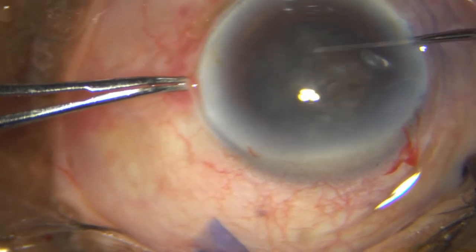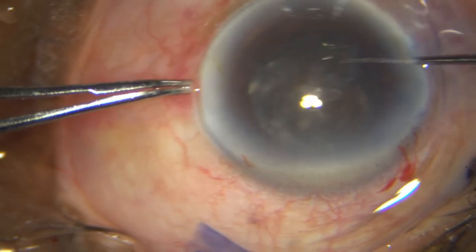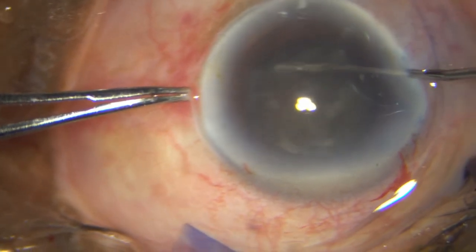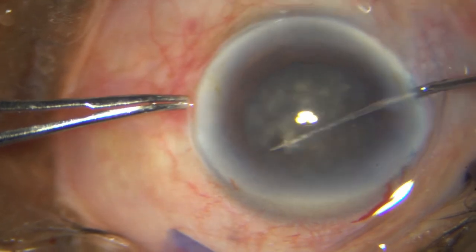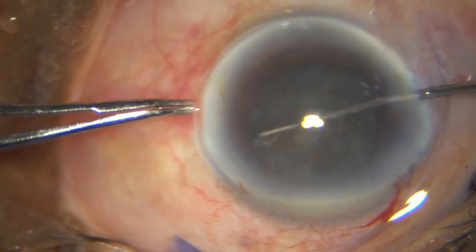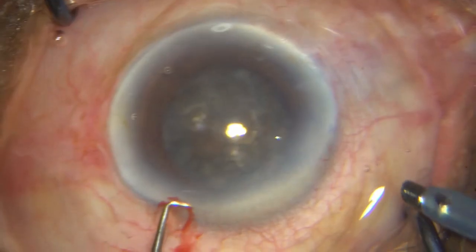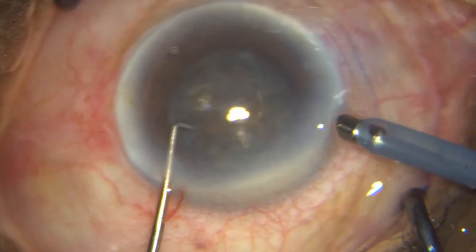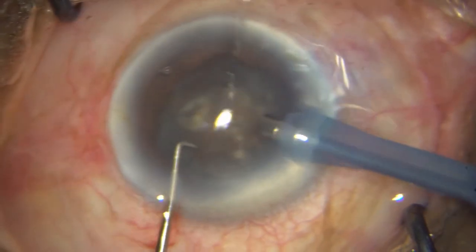I am very gently rotating it to break whatever adhesions are there, and now slowly it's rotating freely. This step has to be done extremely carefully — you can have zonulodialysis. Keep watching the space between the pupil and the anterior lens capsule. I have taken a very sharp long chopper, and I am going with 80% FACO power, 400 mmHg of vacuum, and 40 ml flow rate.